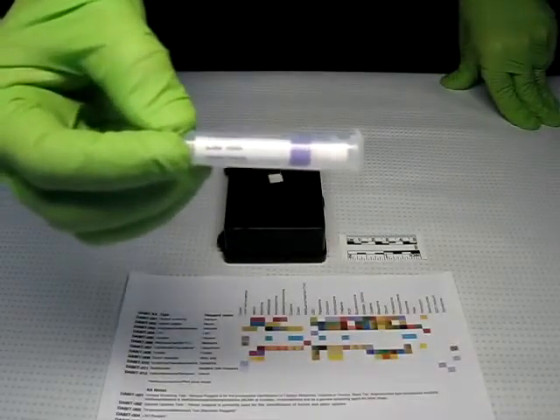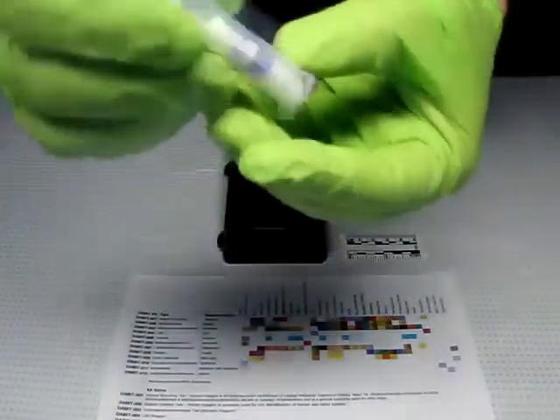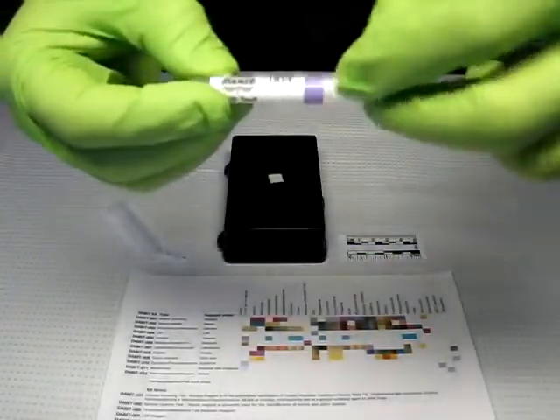Here we are going to demonstrate the DABIT 004 LSD test. Remove the sampler from the clear outer tube. Remove the protective paper from the sticky sampler tip. Dab the sticky sampler tip on the material to be tested.